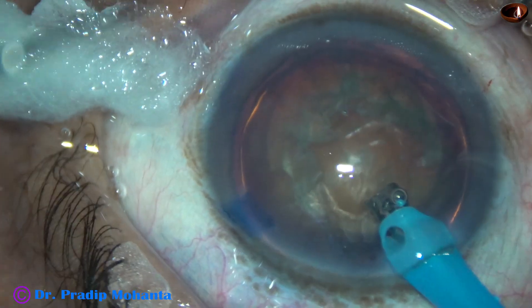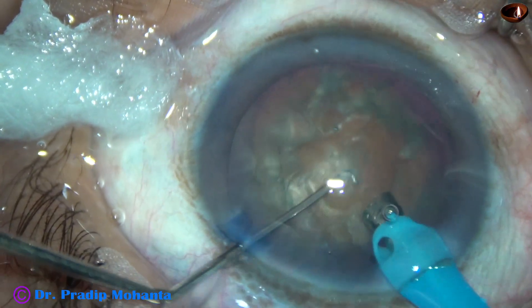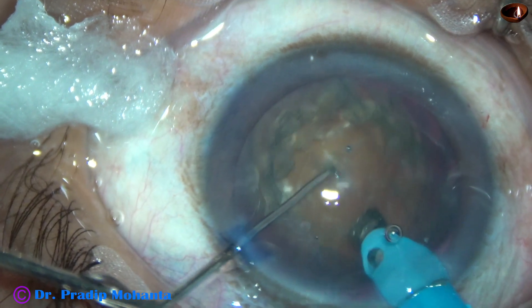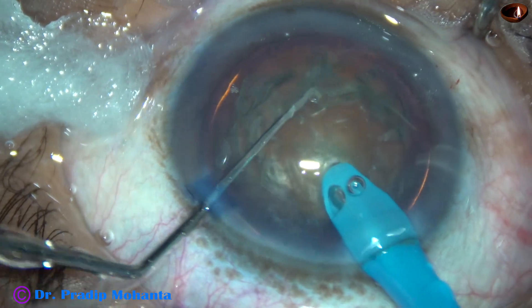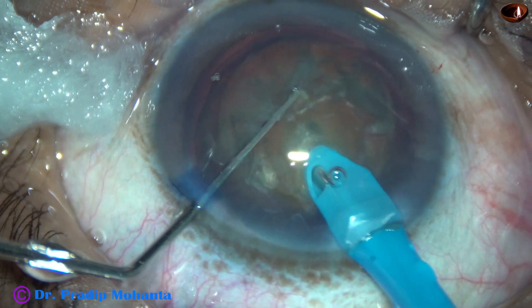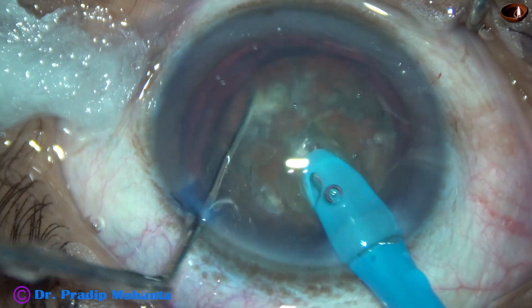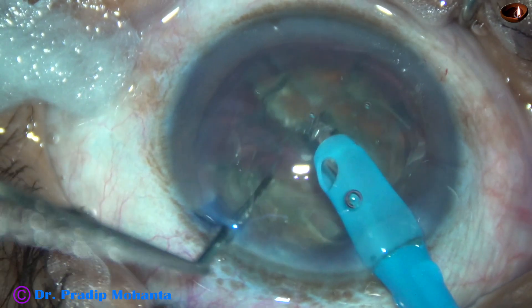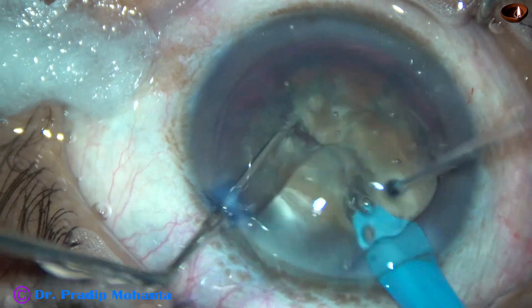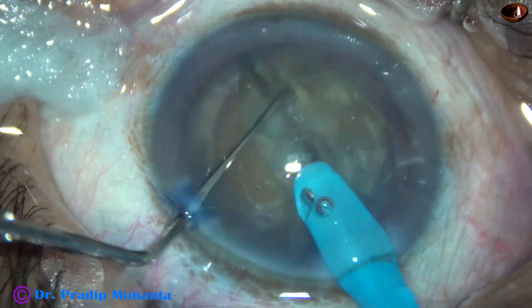This is a chopper designed by me, just like a Szynski hook but a little stouter. The teeth go into the substance of the nucleus, traveling through it like a submarine. Now it is chopped and divided. This is a good crack, but it is not from one end to the other end.